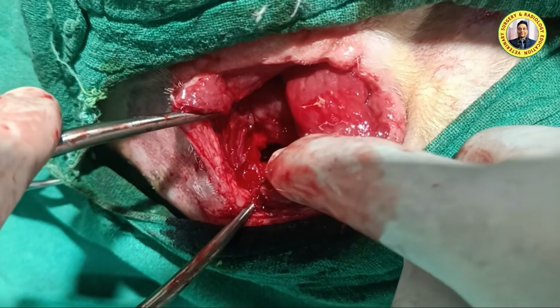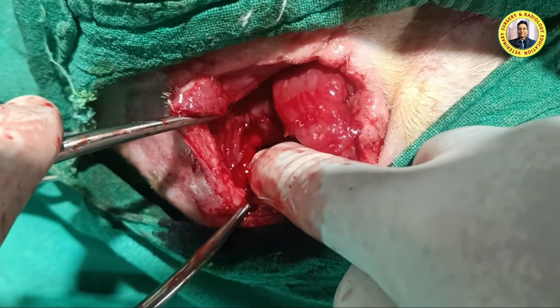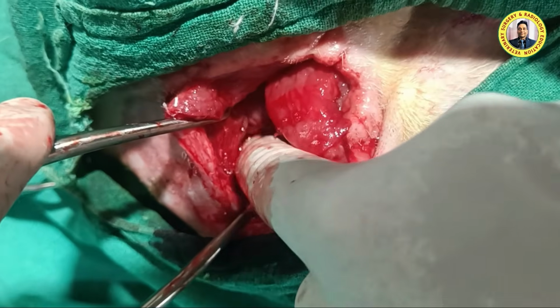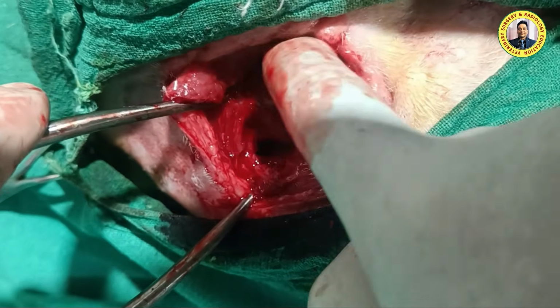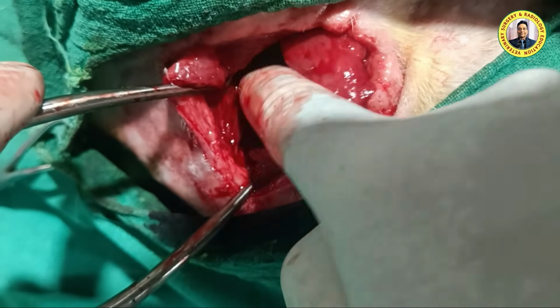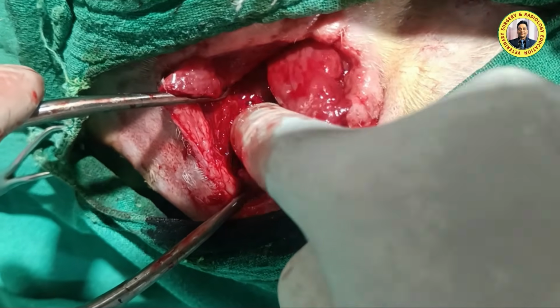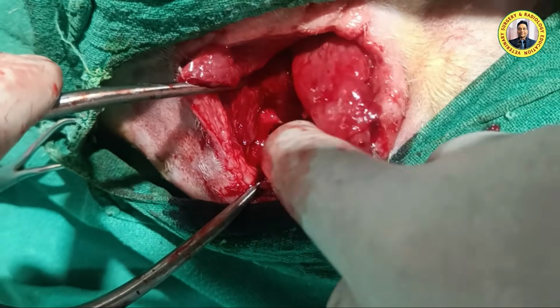For this, we have to pre-place the polyamide thread. This one is the sternum. From the sternum this rib has started, so we pass circumcostally, taking the rib here and here.